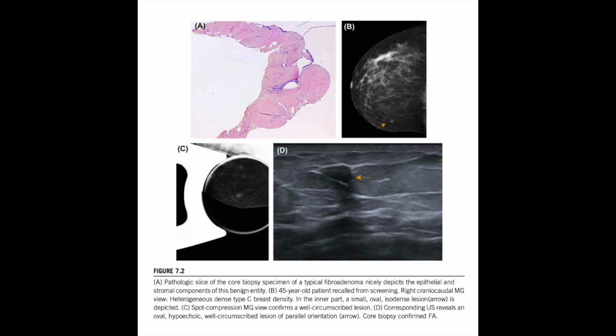So we have to begin with the foundation, which is the ACR BI-RADS MRI lexicon. The standardized language, basically. It's the international language radiologists use to describe what they see, especially masses. When we talk about benignity, we're really talking about visual predictability. Okay, so let's get into that. What are the visual cues that just scream low suspicion? The things that offer that instant reassurance?